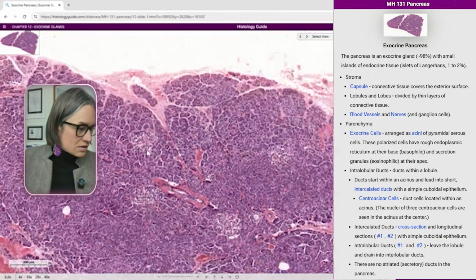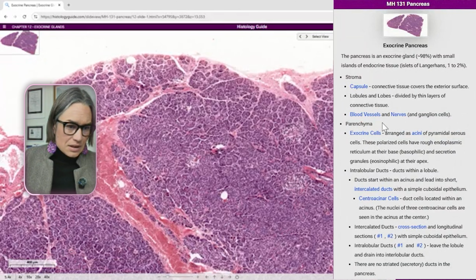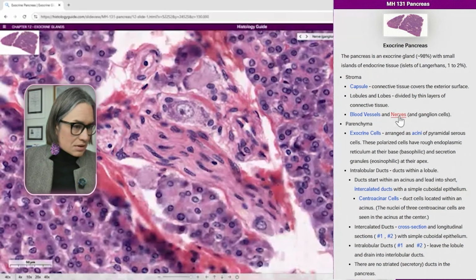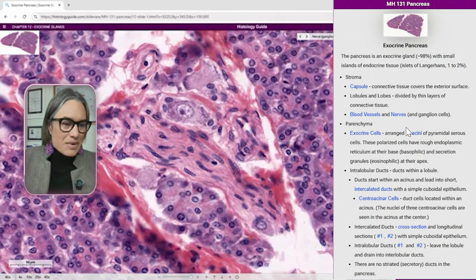Blood vessels we saw. Do we have any nerves? Do we see any nerves? Because they also say, oh, maybe just look, they're so good. They're amazing. So this is a nerve. They have all these places marked.